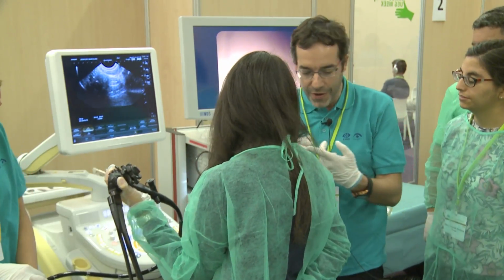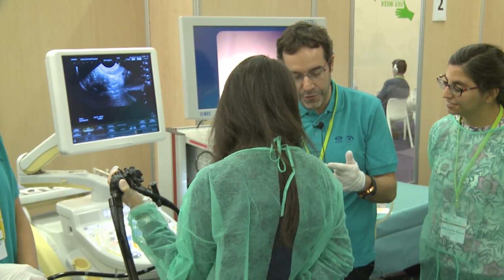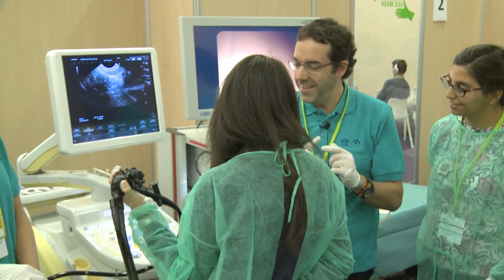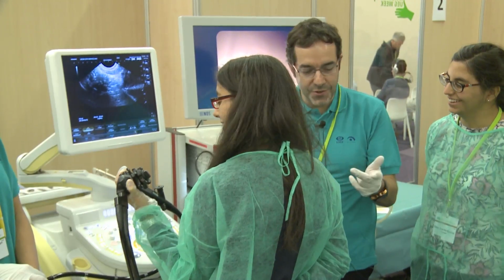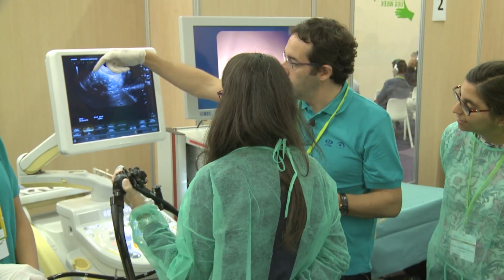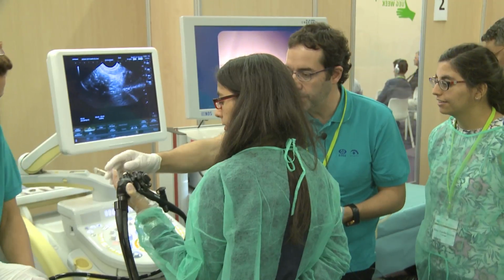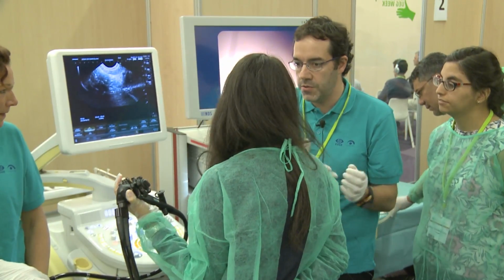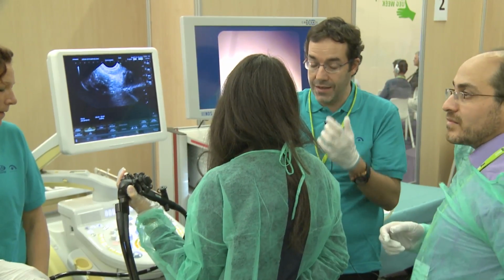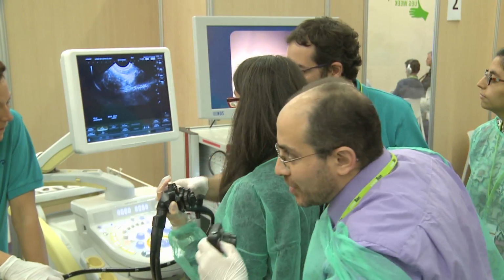EUS. Your usual position for endoscopy when you're doing an upper GI and a colonoscopy is to have your finger insufflating air and never aspirating. In EUS, never insufflate, always aspirate. So you need to change your fingers to a different position, because if not, you are going to have a lot of air, and all of those white lines is air. So that's what you didn't see. You just need to be aspirating. If you find sometimes that the image is not changing, it's because you may have some stomach inside of the lumen, so it's like when you suck. You need to release suction for a moment, and then move the scope everywhere.